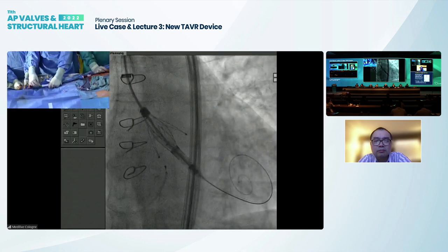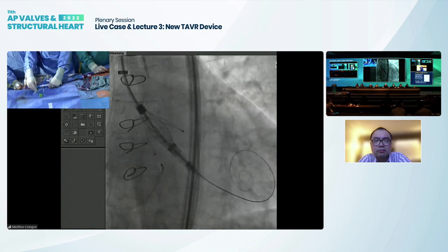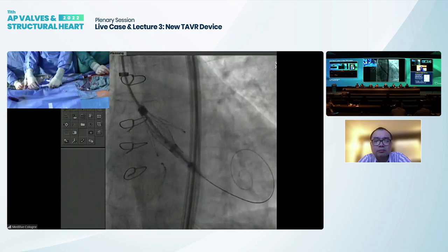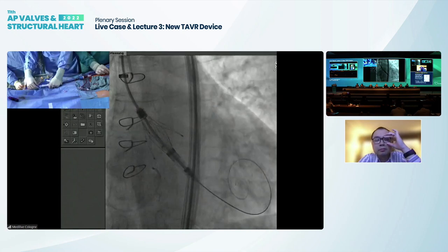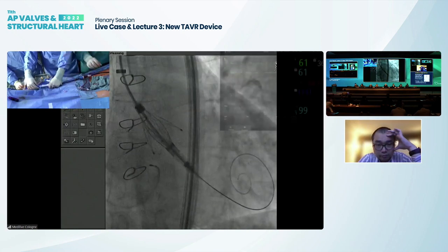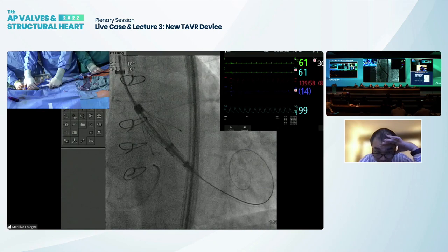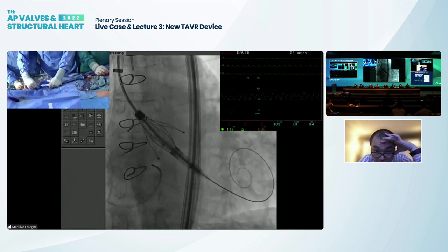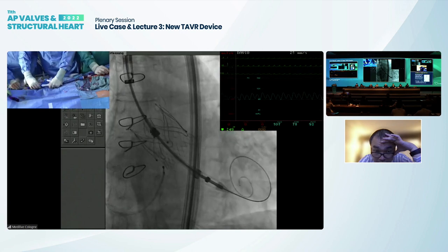Thank you. So I removed the security clip here. 140. And then it's just a turn and push mechanism at the end of the system here. Okay. Keep the pressure on the system. Everybody's happy, right? Not yet. Pacing is not on. Fast, okay. Yes, please. So pacing is on with 120 just to stabilize everything. So I release that one. Okay, off we go. Turn, push, Ingo. And release.